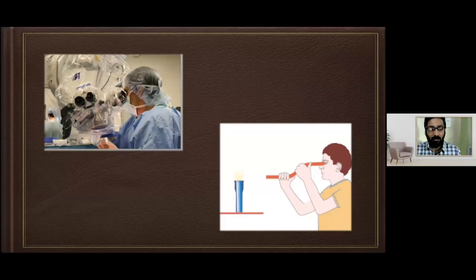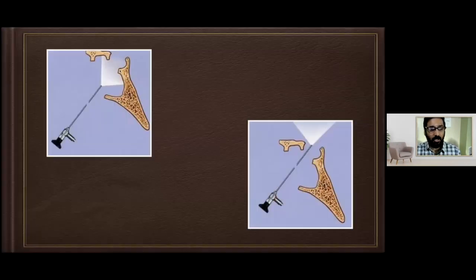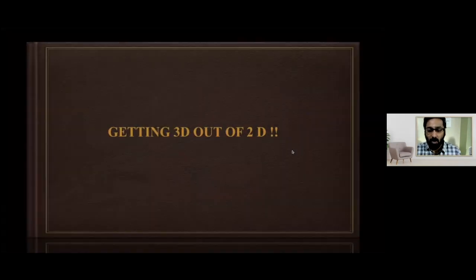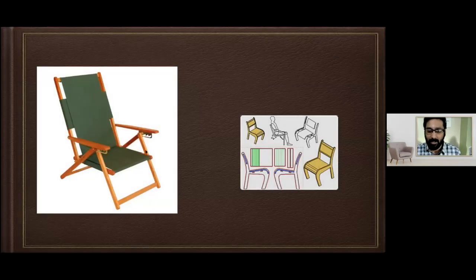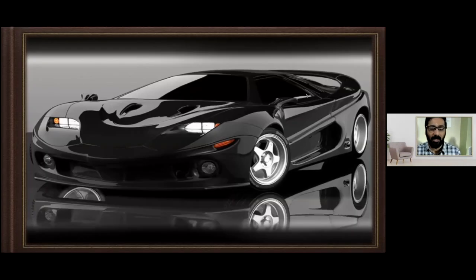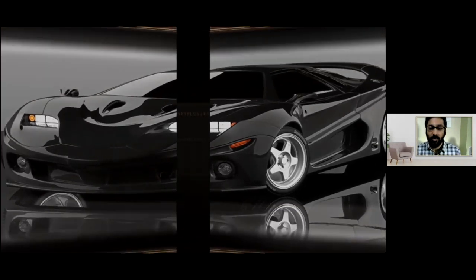The only problem with the microscope when you do endoscopic skull-based surgery is that it gives very tubular vision, so you're not going to get a panoramic view. But when you use an endoscope, you have the principle of divergence. So it's the principle of convergence from the microscope gone on to the principle of divergence, and you can take your eye right into the skull base, so you can see the structures better. The only problem is some people complain that you have a 2D effect rather than depth perception. But I'm sure that with practice, you will start developing that.